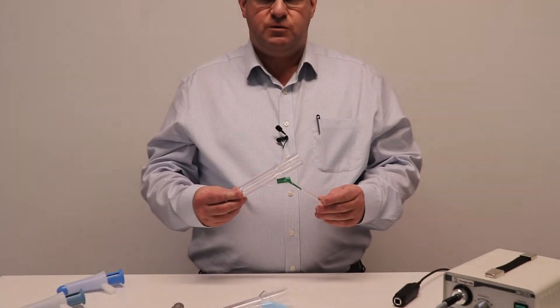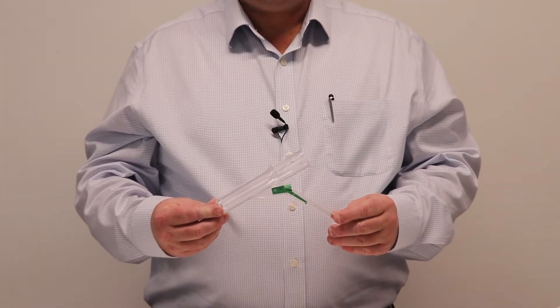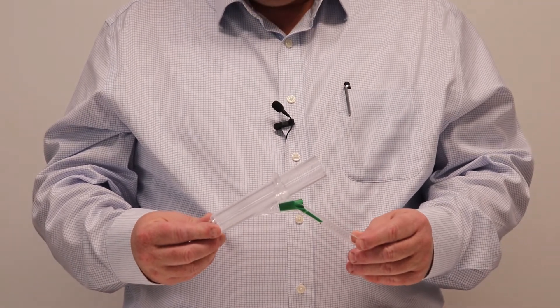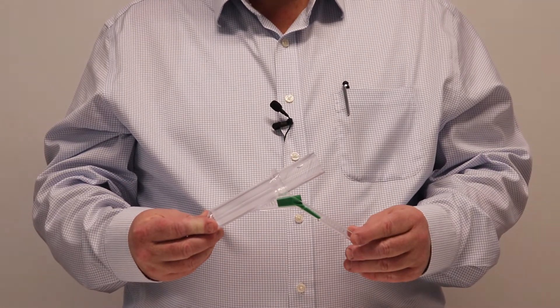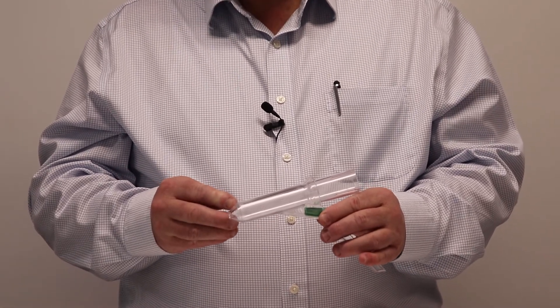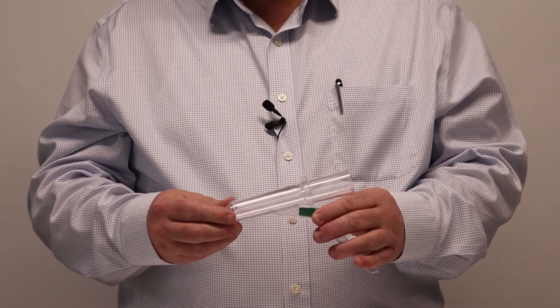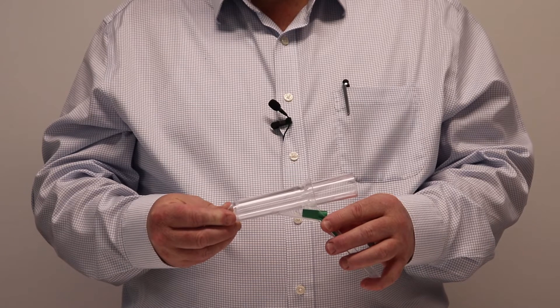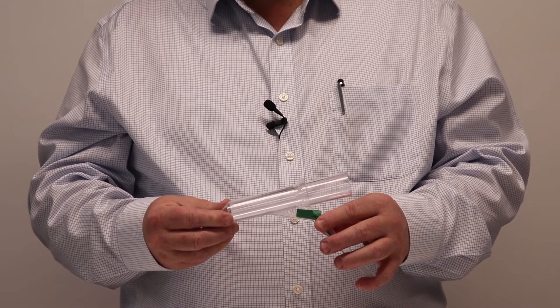The solo proctoscopes, as you see here, offer a high quality single-use solution. These are manufactured in Sweden. They have a very fine transition between the obturator and the distal tip of the proctoscope. This makes it easier for the surgeon to insert and more comfortable for the patient.